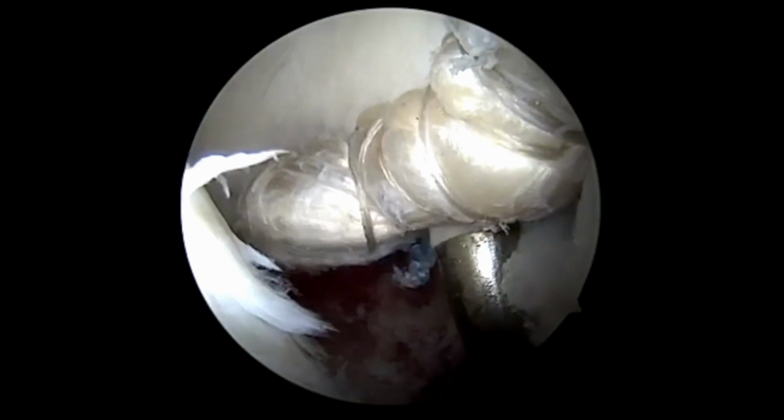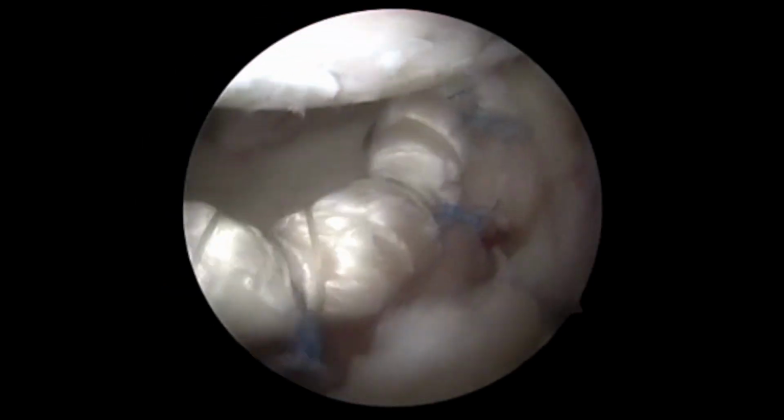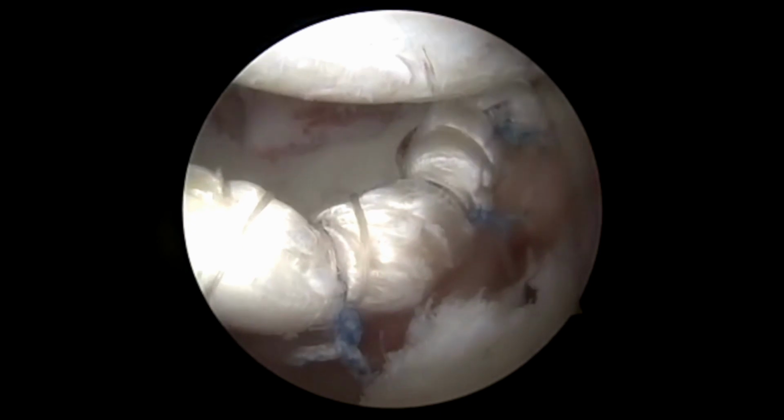The medialmost anchor is then used to tie down the medialmost aspect of the graft through the mid-anterior portal. Subsequently, the middle anchors are then used to tie down the middle aspect of the graft, and the other anchors are sequentially tied to completion. Upon completion, the graft was noted to provide excellent recreation of the labrum.